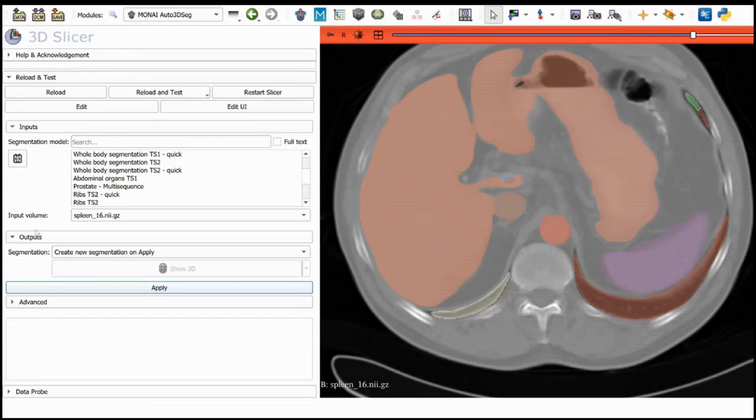So one use case, for instance, is using XNAT. So we organize the data set, or they organize the data set, pull all the data set from the PACS system, put it in XNAT, and then consume MONAI Label as a service. So you train a model using the images that you created using XNAT, or you want to run inference on a pre-trained model. So you're using MONAI Label as a service. Another use case is I want to create a reviewer platform where I have a pool of annotators, junior annotators or expert annotators. So I use MONAI Label as a layer, right? I'm not experimenting with that. So it depends on the use case. There are several use cases.